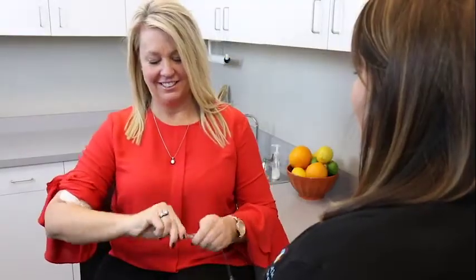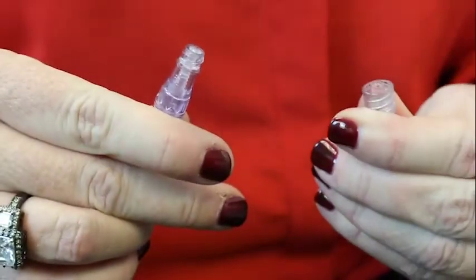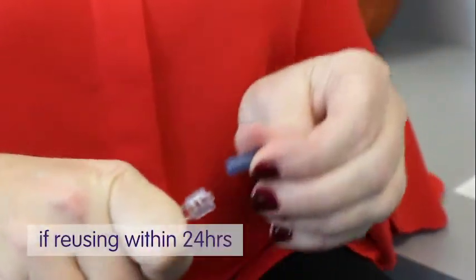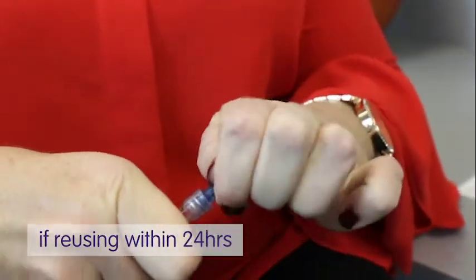Disconnect the IV tubing and discard all equipment as instructed. If the tubing is to be used again within 24 hours, cover the exposed IV tubing tip with a sterile cap provided.